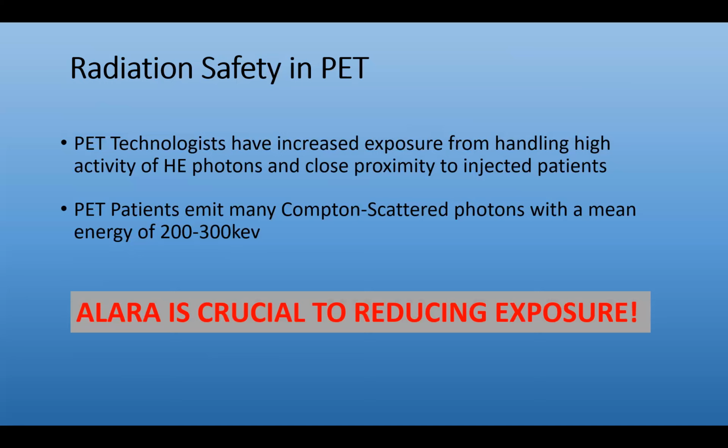So ALARA is particularly crucial to reducing radiation exposure, and they take radiation safety very seriously at PET, to the point where they actually have their own radiation safety officer on site.